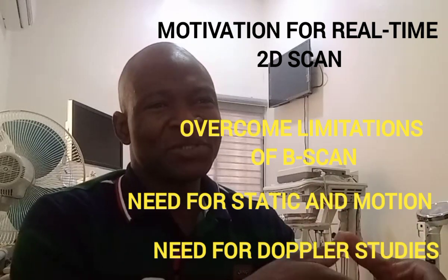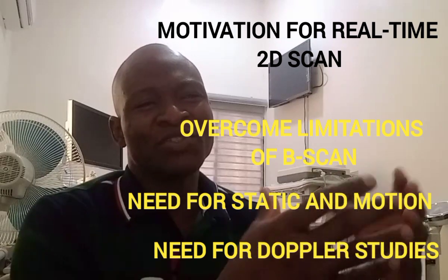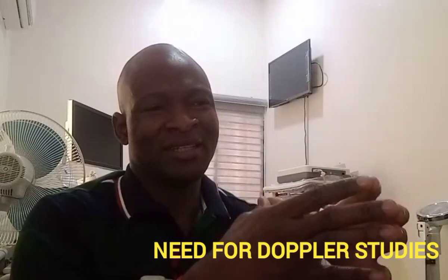So the real-time pictures are automatically produced by the ultrasound system electronics by acquiring a large number of scan lines and combining the scan lines into a 2D picture. But initially this was done by mechanical real-time transducers, which were superseded by electronic array transducers in the 90s. Those electronic array transducers have significant advantages over mechanical transducers and are standard equipment on all modern ultrasound systems today.